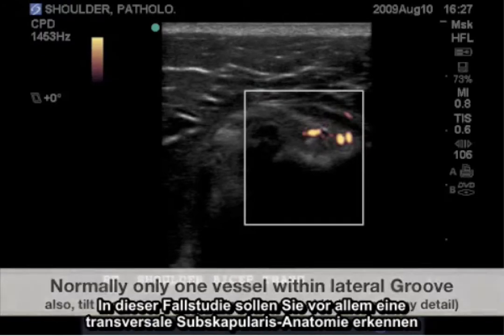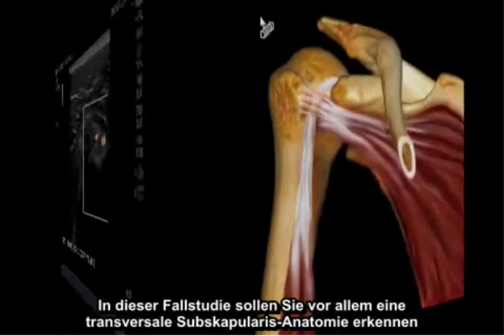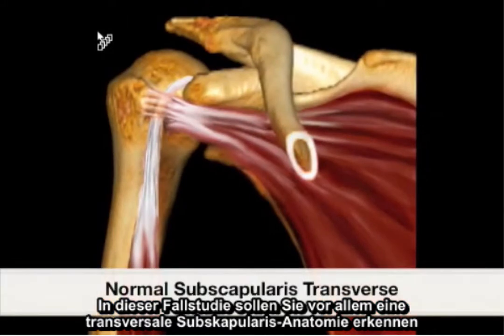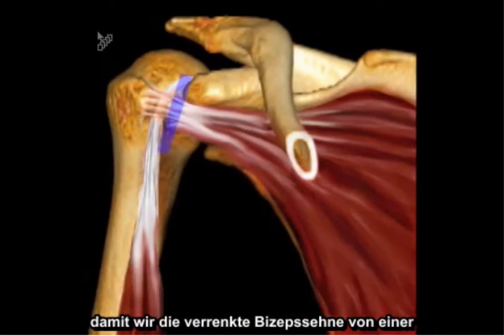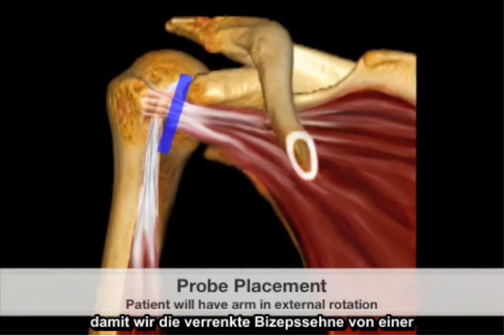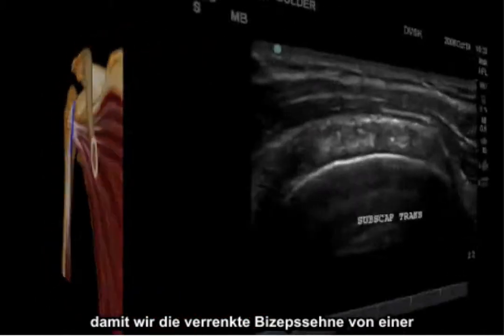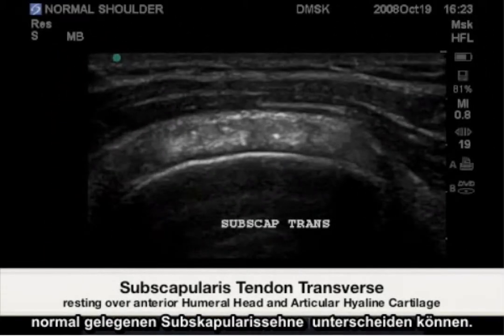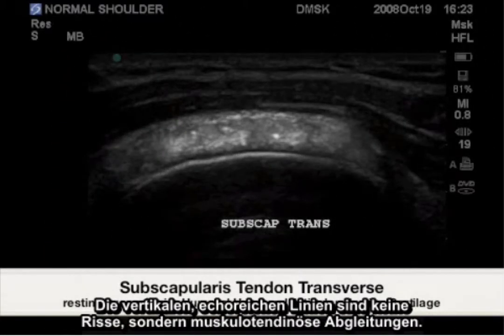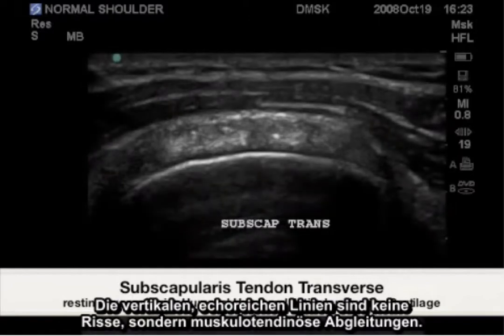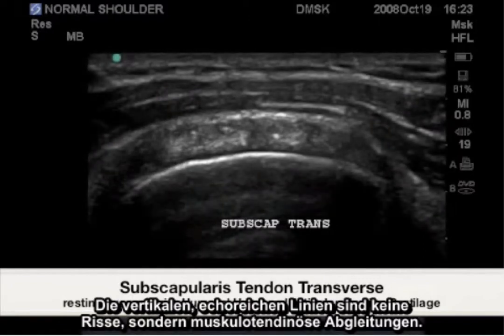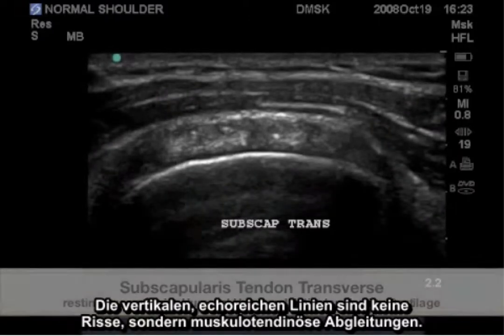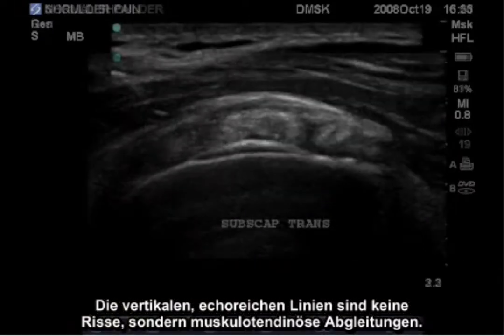In this case study, I would like you to recognize the transverse subscapularis anatomy primarily so that we can distinguish the dislocated bicep tendon from where a normally situated subscapularis tendon should be. The vertical hypoechoic lines are not tears, but musculotendinous slips.